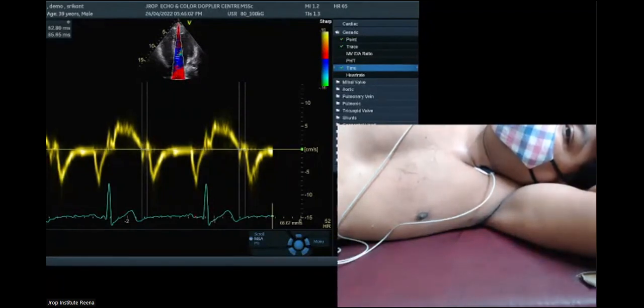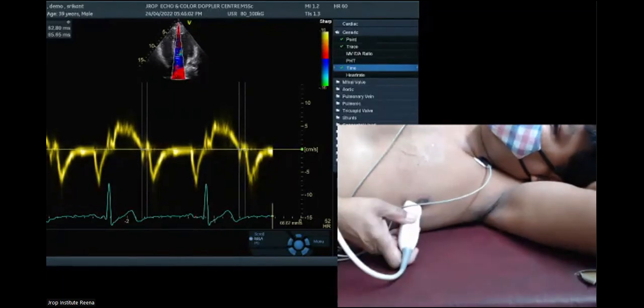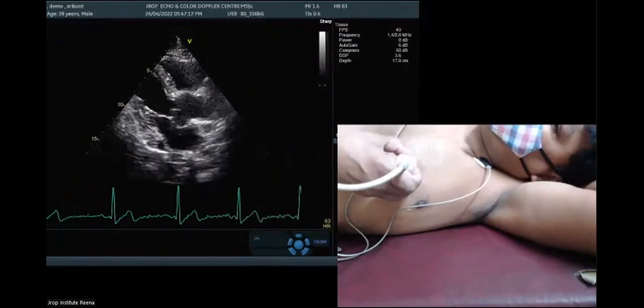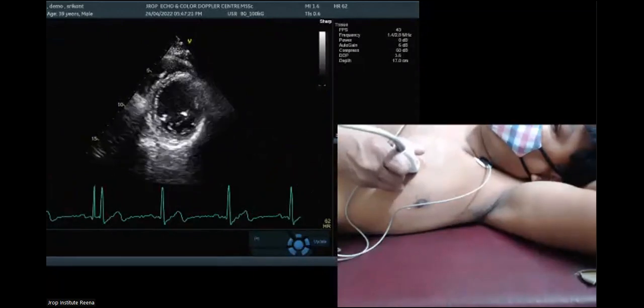One or two things more, then I'll start taking up questions because that will give you a sanctity of looking at this particular imaging quality. I want to show you the mitral valve again. How to take a real cut section. Now this is very clear.